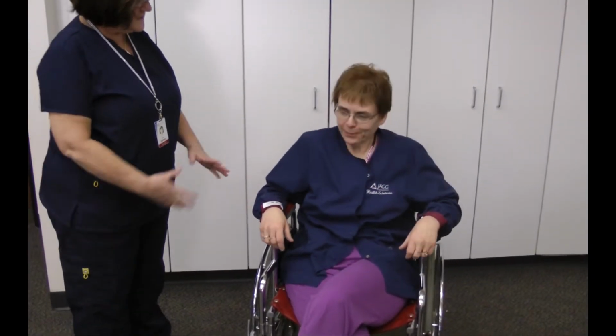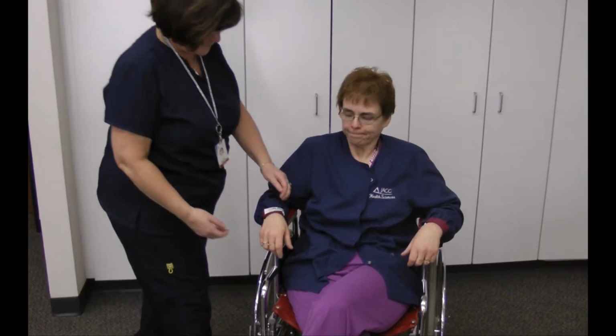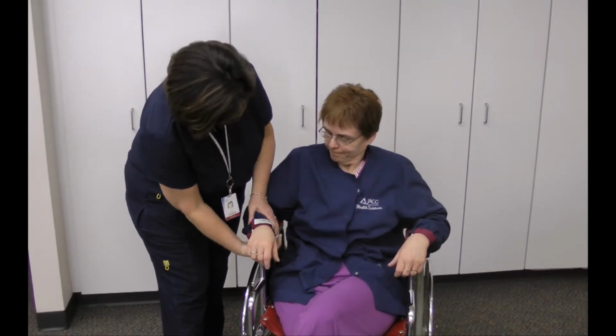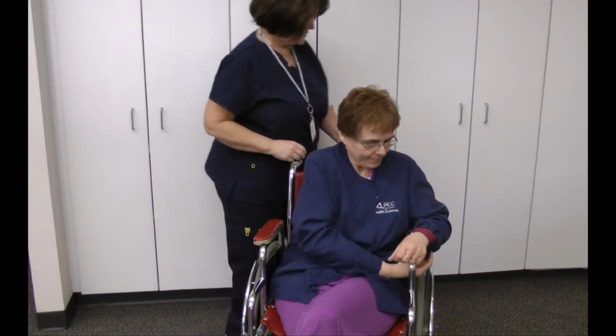Have you seen one of these recently? No. I have not seen a wrist restraint in a long time. Again, it's one pull, and it's more at the hospital, and it releases real fast.